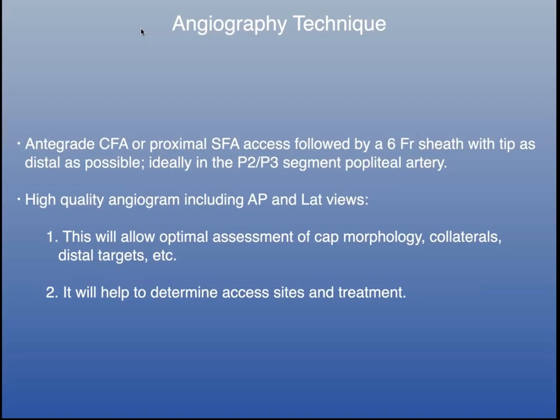Remember, we're not talking about the days when I was a fellow at Miami Vascular, where we were doing basically vessels which were diseased but open for the most part, or short segment occlusions. We are talking about true CLI now with long segment CTOs, heavily calcified, disease from groin to toe and foot.